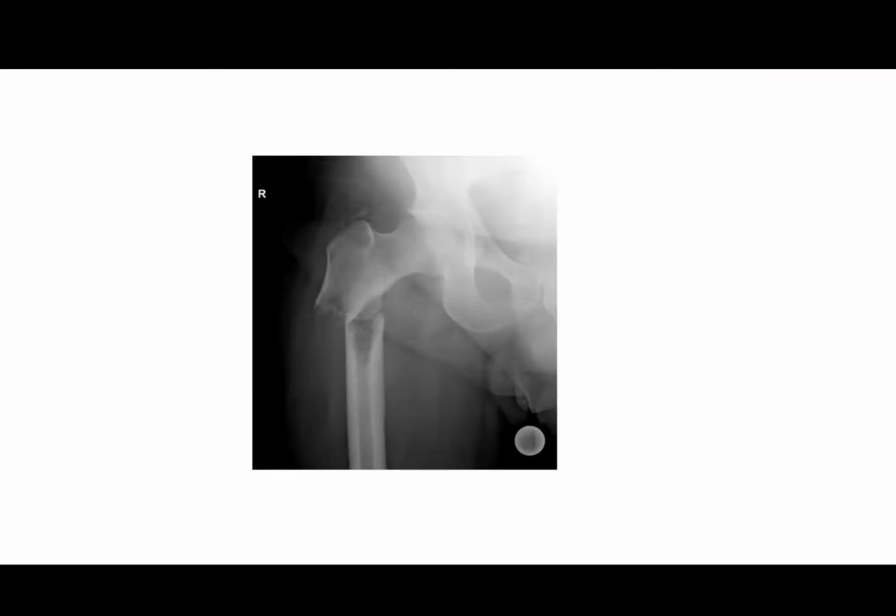And at the end, don't say it's a bisphosphonate. You don't know. So there is a lytic lesion, and you don't know what this is. It could be a bisphosphonate, but don't say it at the beginning. Good job. Thank you. And you said about the lateral, right? You said, I would like to have a lateral X-ray.